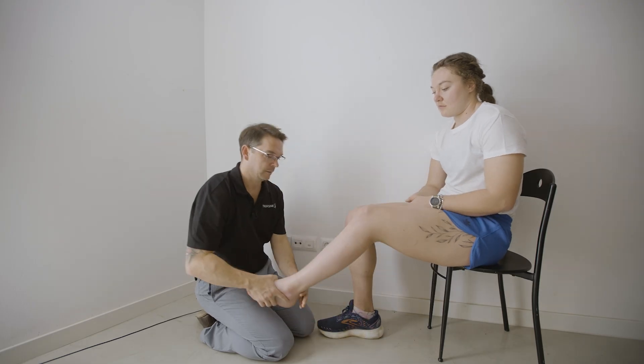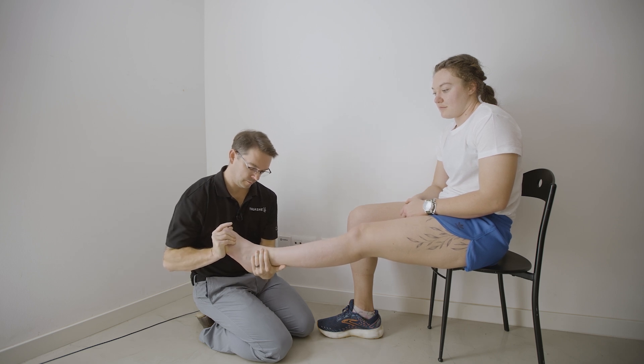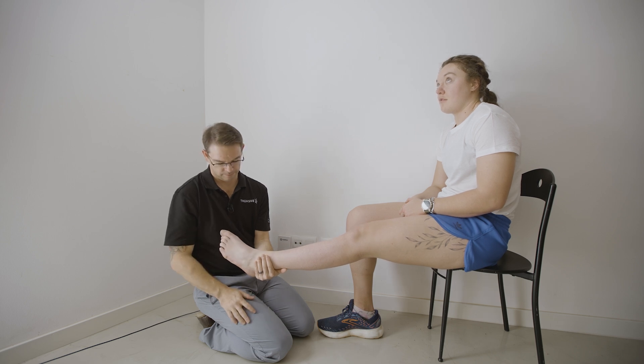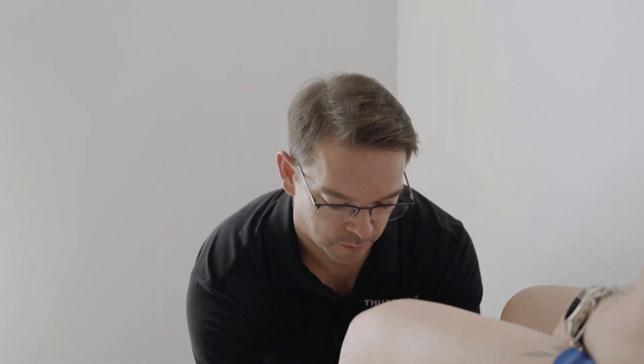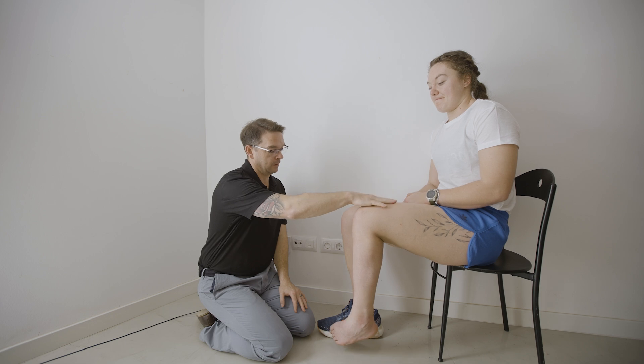Let's just do your foot again. I'm going to try and push you up. You've definitely got some plantar flexors. Can you lift your foot up for me? You would have a flicker — a muscle power of one — but you do not have the range. Can you lift your knee up? Hold for me. That would be a muscle power of three plus because you are able to lift it against gravity, and I am able to push down and you are still somewhat able to resist me.